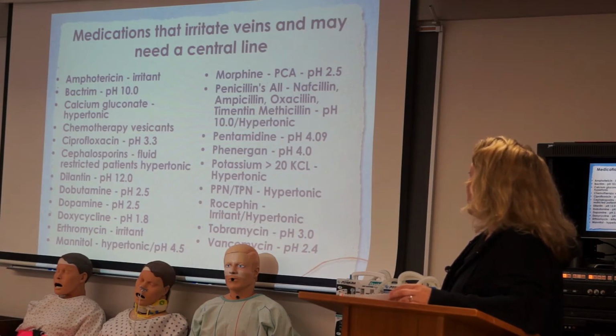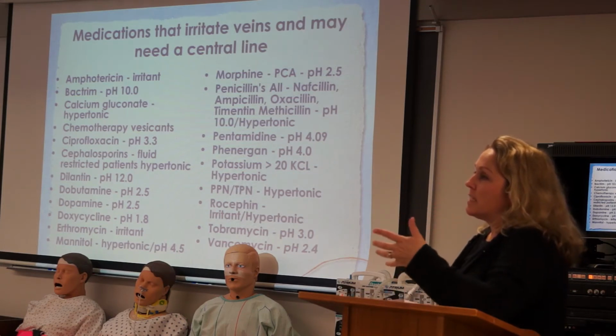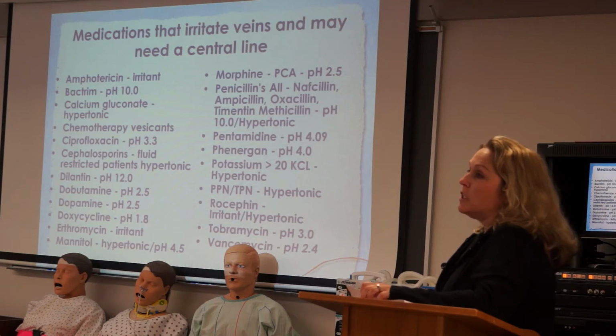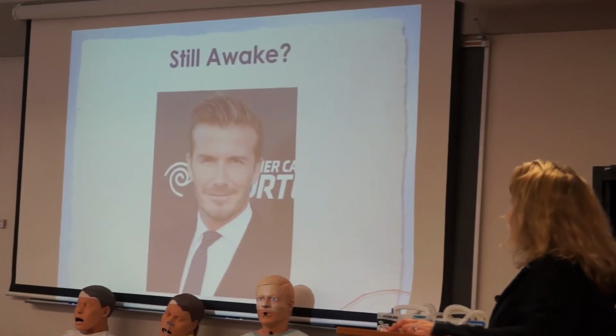So don't be alarmed by that. But if your patient's going to be on long-term vancomycin, you would want to suggest to the physician that the patient get a central line, probably a PICC, because they might be going home with that medication, and the PICCs can go home with patients. Midlines can go home with patients. So just be aware of that.